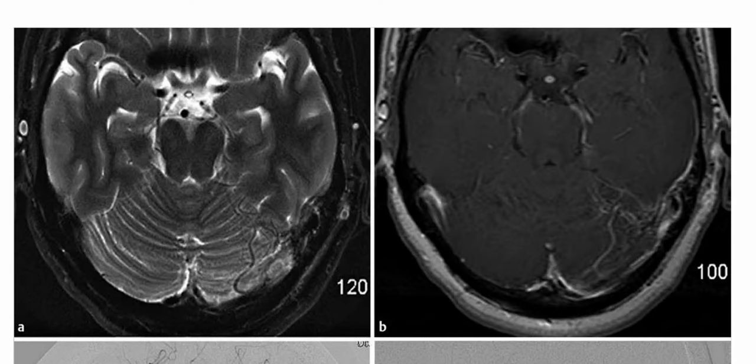So as you can see, on the axial T2 MRI, there are increased flow voids extending along the tentorium on the left side, extending to the distal transverse sinus. The axial T1 post-contrast MRI reveals corresponding vascular enhancement here.